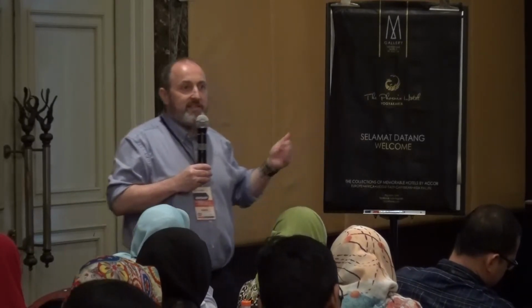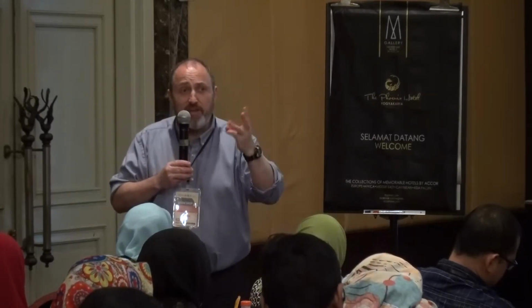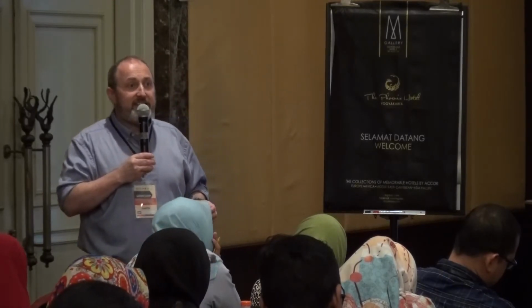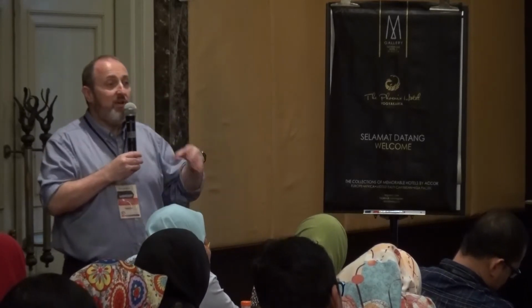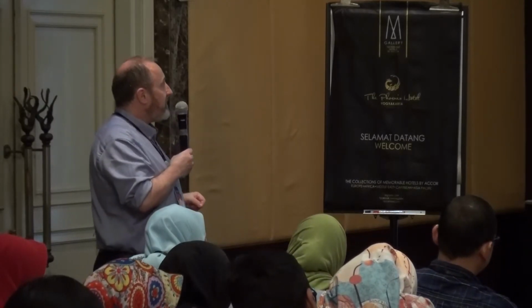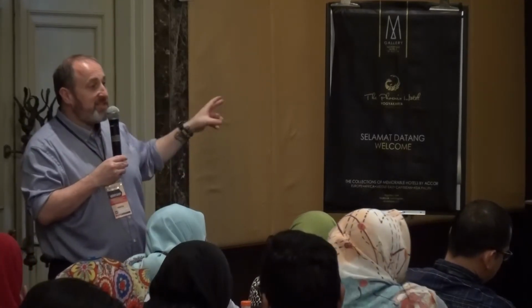In terms of classifying it, NICE recommend, if you're a class on the RCOG, if all of those 3 features are reassuring, the tracing is normal. If 1 is non-reassuring, the tracing is suspicious. If 2 are non-reassuring or 1 is abnormal, the tracing is pathological. And there are some actions listed on the right-hand side of that table, which is in your handout, and you will be able to read that easily, which show what you should be doing in terms of suspicious and pathological tracings.